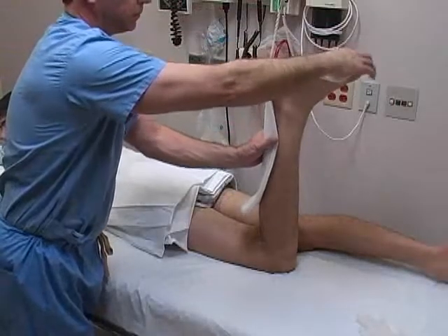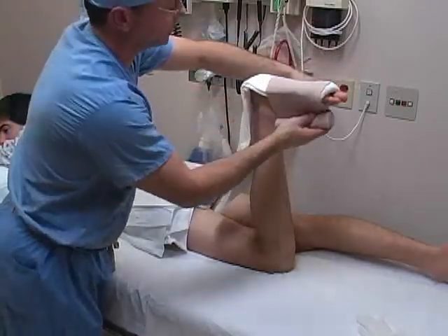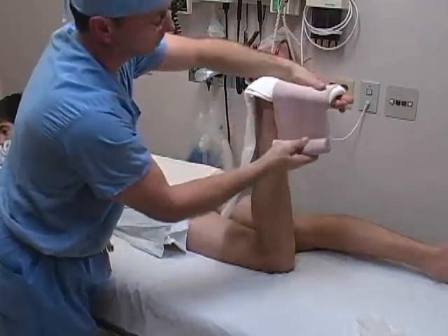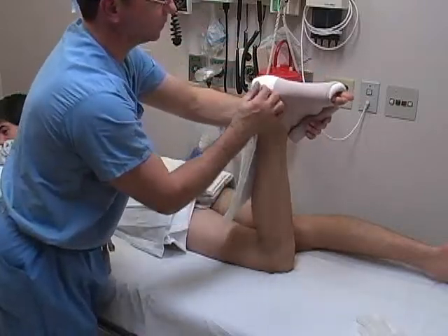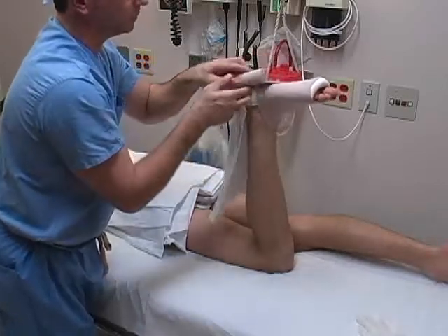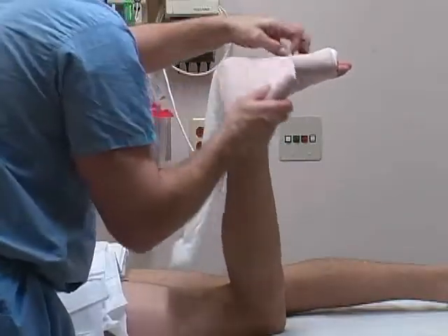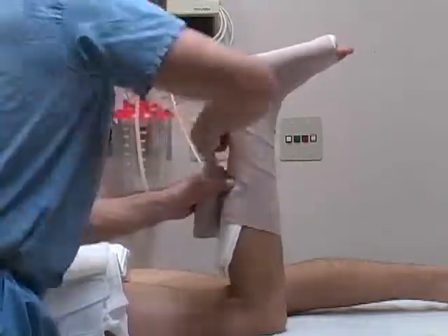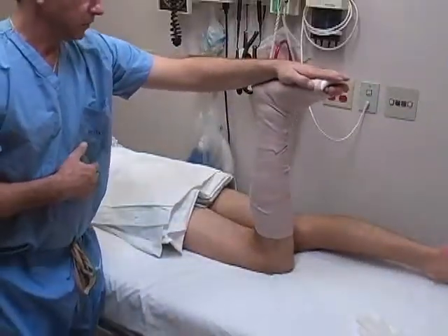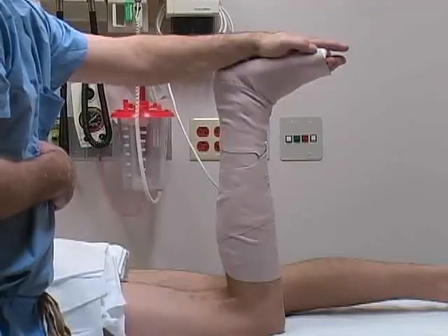Apply the splint along the posterior aspect of the lower leg. Use 4- or 6-inch elastic wrap to secure the splint to the patient. Begin distally at the toes and progress proximally up the leg, taking special care not to create large wrinkles or creases in the plaster in the heel region. Overlap each pass of the elastic bandage by 50%, applying a moderate amount of tension as you progress. Gently mold the splint to the patient's leg. It is important to splint the ankle at 90 degrees of flexion.